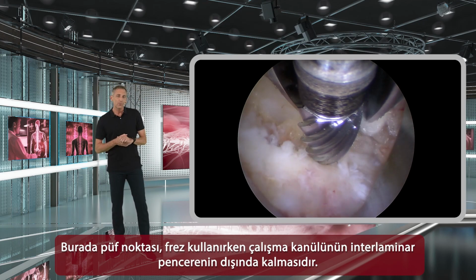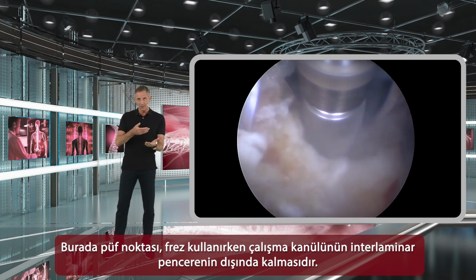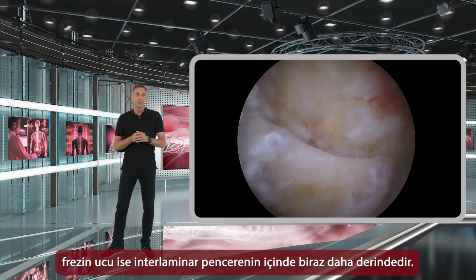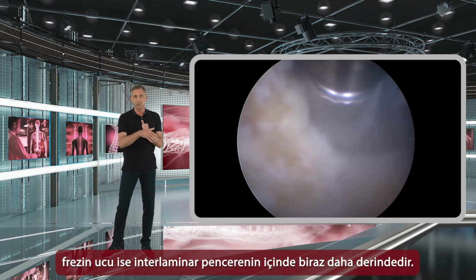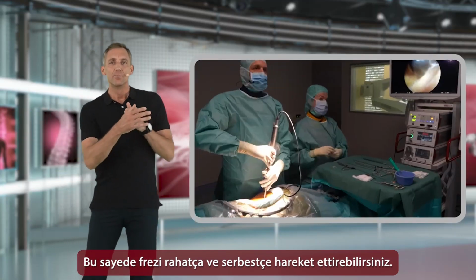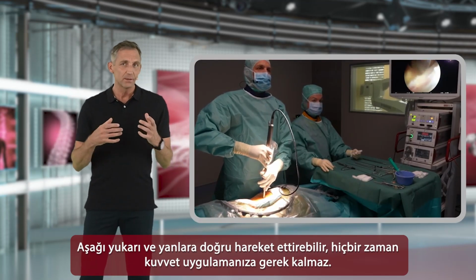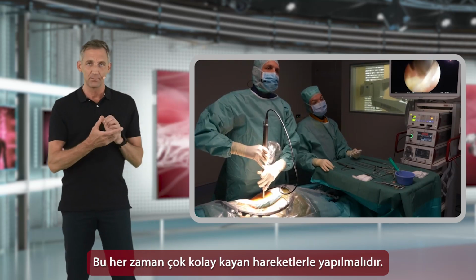The trick here when using the burr is that the working sleeve will stay outside of the interlaminar window and is basically resting on top of the facet joint, whereas the actual burr is a little bit deeper inside the interlaminar window. And this way then you can easily and freely maneuver the burr, you can go up and down and laterally, and you can make sure that you will never need any force. These are always very easy sliding movements.